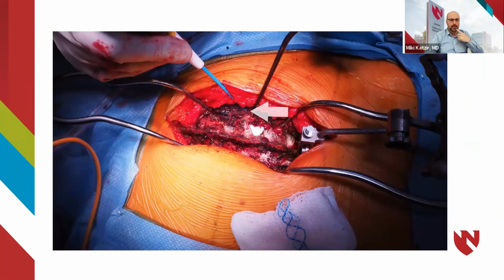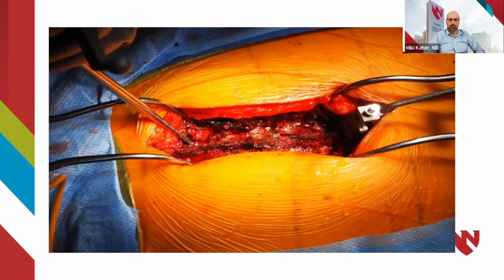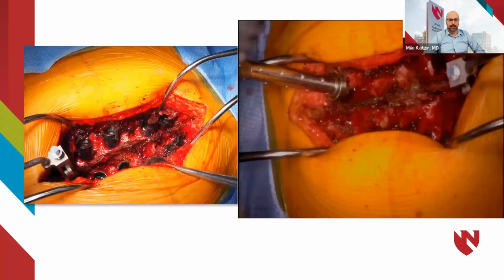This is the general exposure. We can see the navigation array to the right of the patient. We are drilling the pilot holes, cannulating the pedicles. This is the carbon fiber screw going in.